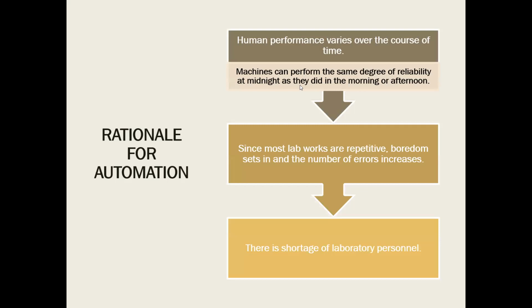Number one, human performance varies over the course of time. Kapag pagod na pagod ka na, pwedeng minamadali mo na lang. Kapag masyado kang maraming ginagawa, pwedeng hindi mo na siya naiisip ng husay. Or, if you are not focused on what you are doing, you might have a problem in dispensing the serum and dispensing the chemical that can cause a serious problem in our testing.